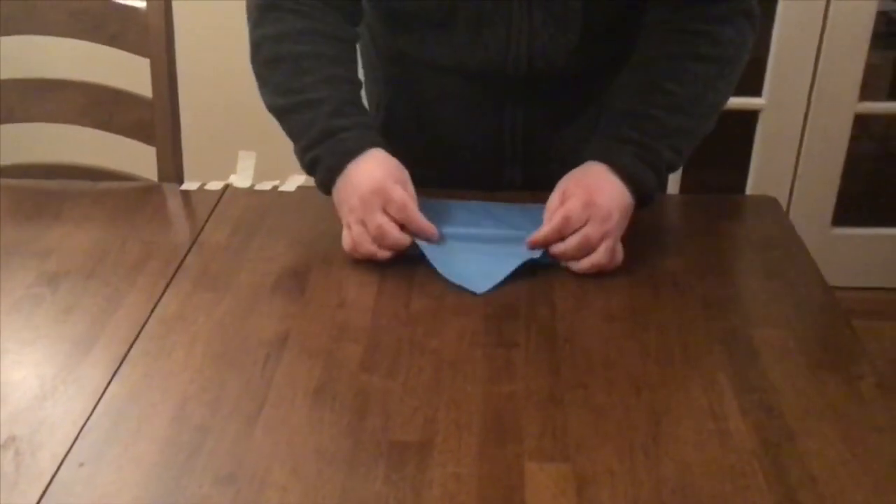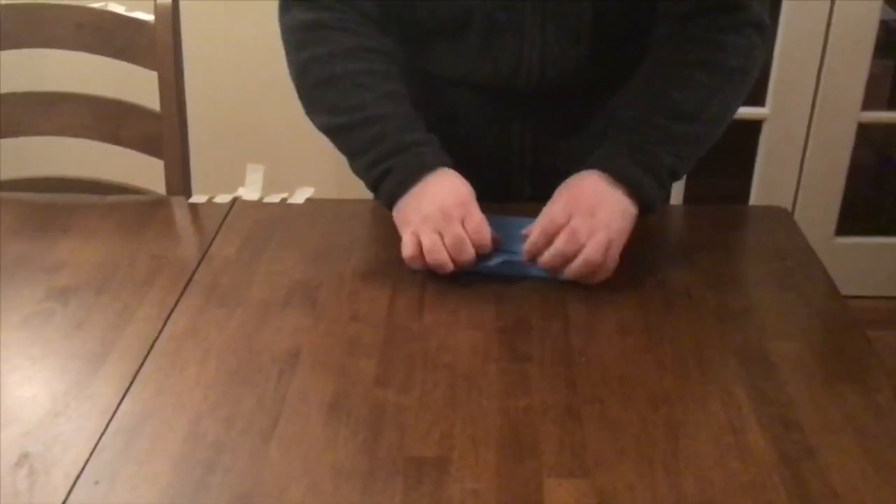At the end, make a flap that allows the pack to be opened easily. Secure with tape.